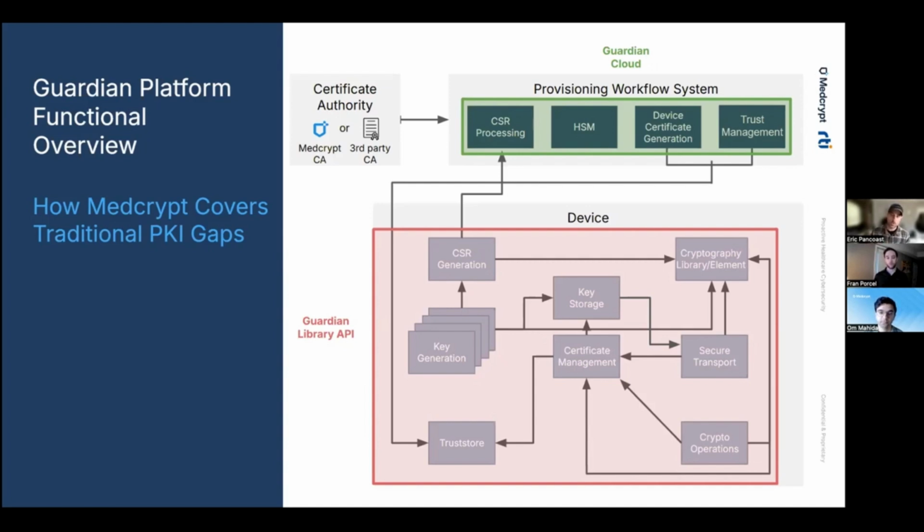And the Medcrypt Guardian solution provides the necessary infrastructure and tooling to make it easy for engineers to establish that cryptographic security with the trusted keys in their medical device. So the Medcrypt Guardian solution covers the gaps that engineers typically encounter with other partial solutions. For instance, solutions from well-known certificate authorities, PKI vendors, cryptography library providers. There are a lot of pieces that are missing to do this end-to-end in an easy fashion.